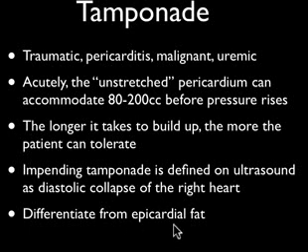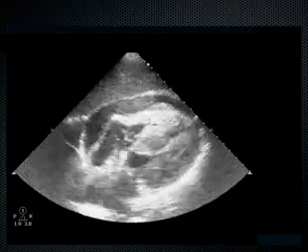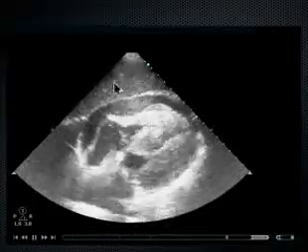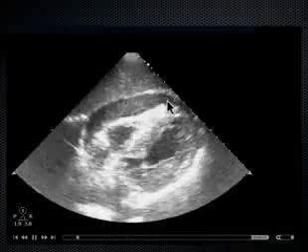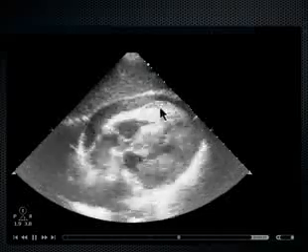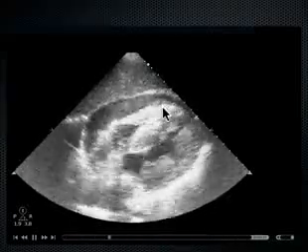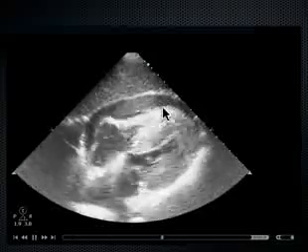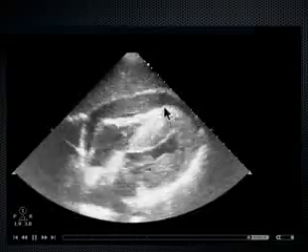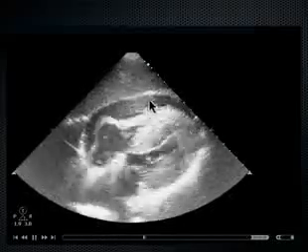Sometimes we see stuff around the heart. It could be epicardial fat, so you want to be a little careful there. What do you think is going on in this view here? A couple things I can see. Number one, it's a subxiphoid view. This is the liver here. We can see the pericardium tracing out here. This is the myocardium, and it's a little subtle, but do you see this area right here that's adjacent to the myocardium? That's epicardial fat. Now, this image is overgained. Yes, like you, I feel like I need to wear sunglasses when I look at it, but just keep in mind that this is a fat pad here. However, this out here is something different. What do you think this is?